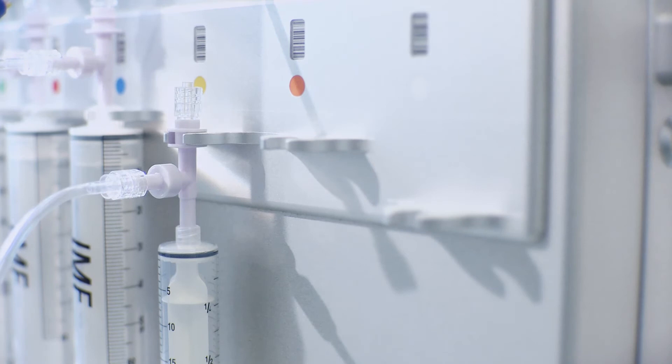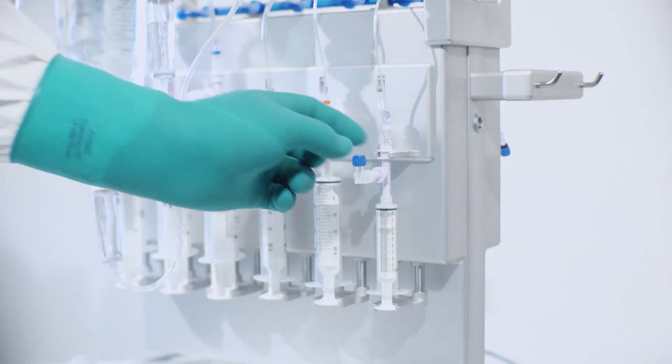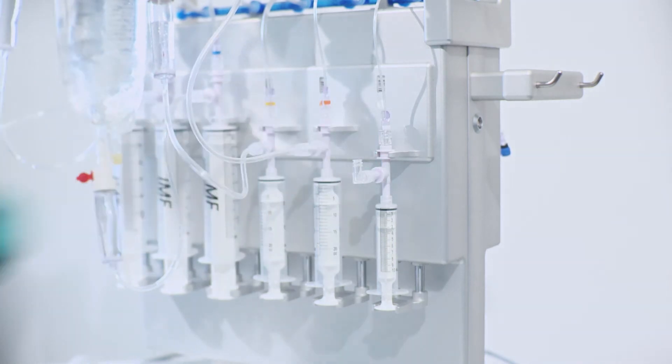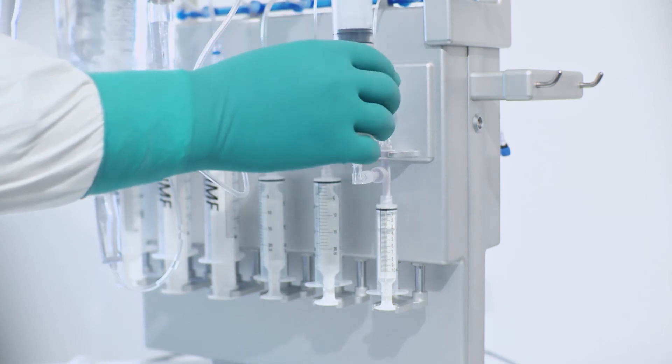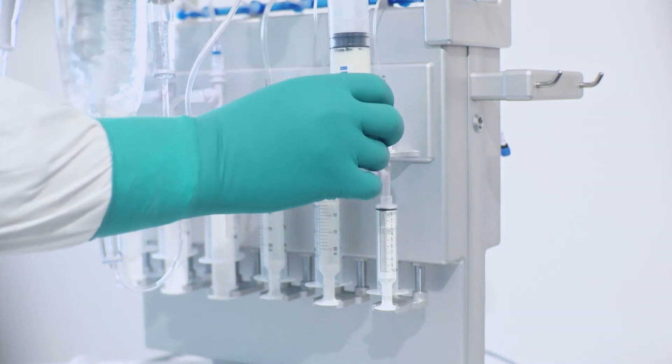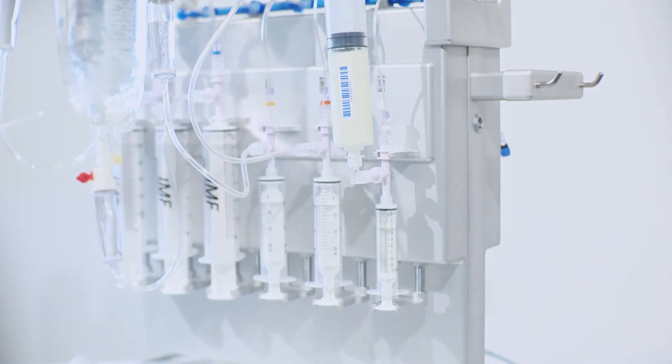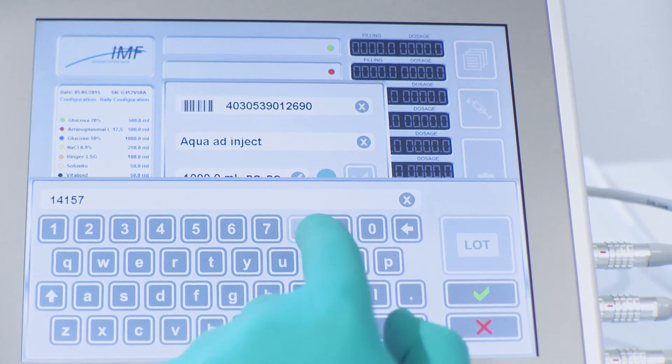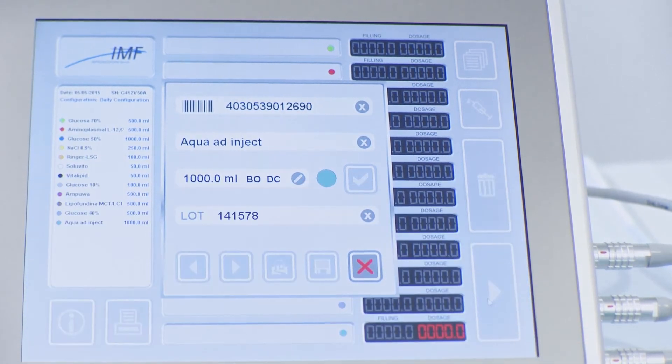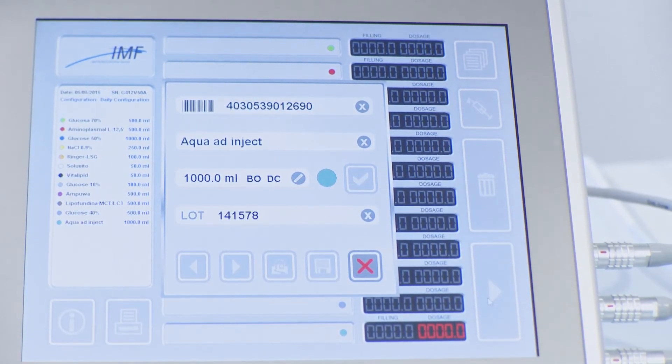There are three different connectors available. Drip chamber spike, vented, for big bottles or bags and with a 15 micron particle filter. This will stop particles and possible rubber particles from the coring of the spike. Mini spike, also vented, ideal for vials or small bottles. Luer lock connector for the connection of reconstituted ingredients, vitamins or trace elements.